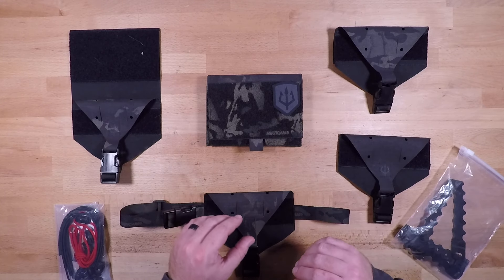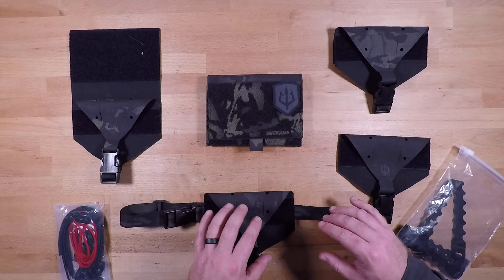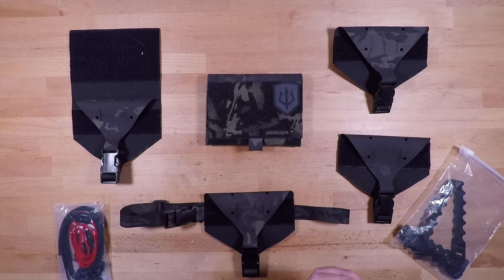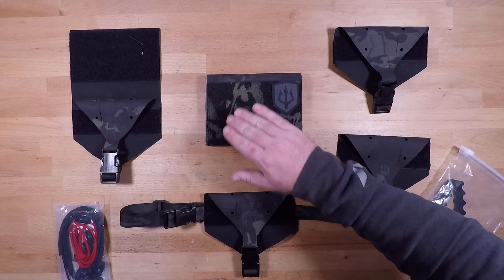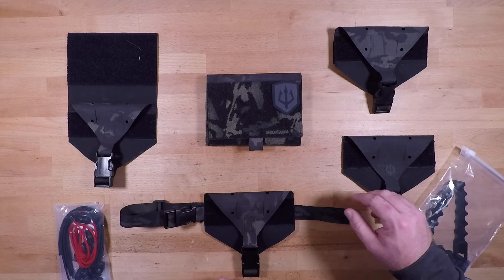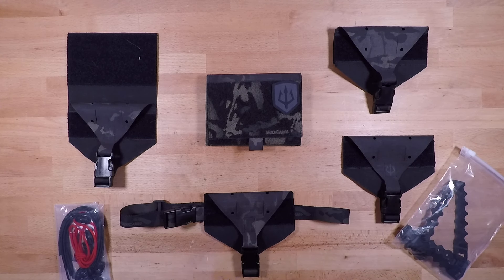Diving right into materials, colors, and camo patterns: this system and all of its components are made out of a PVC nylon denier Cordura, so it is super robust, very abrasion resistant, and does a really good job within that tactical environment of staying together and not falling apart on you. Most of the product is layered with Velcro, and you also have plastic clips. This specific piece has MOLLE capability as well. For colors and camo patterns, you have a couple of MultiCam patterns as well as standard black, OD green, and coyote brown, giving you a lot of options to set this up specific to your mission, operational environment, and duty position.